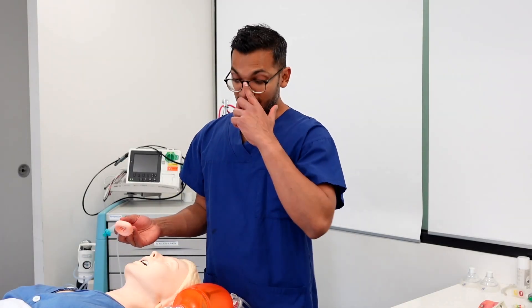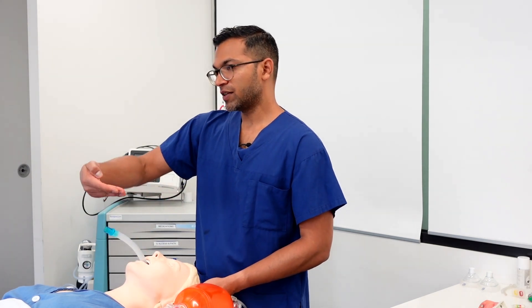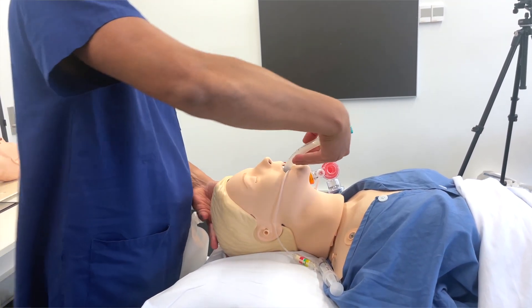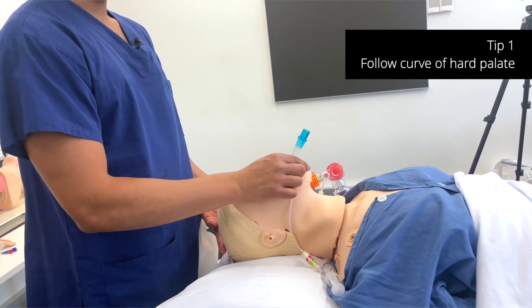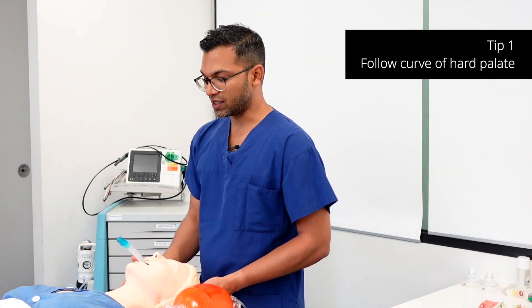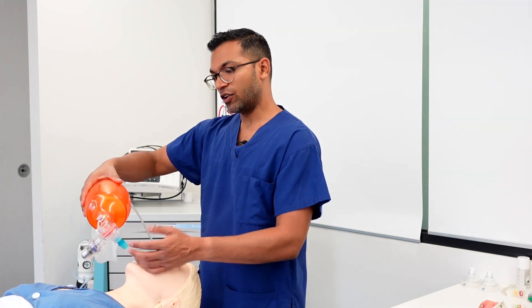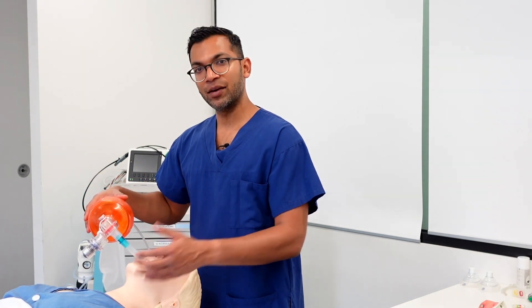One of the common things that happens is the LMA gets stuck at the posterior pharynx. What you need to do is follow the curvature of your hard and soft palate and then push it around the tongue — forcing backwards with a bit of pressure allows it to get past the tongue more easily. No matter what you're doing, you have to continuously assess that you're ventilating: rise and fall of the chest, fogging in the tube, and hopefully an end-tidal CO2 trace, as well as appropriate saturations.